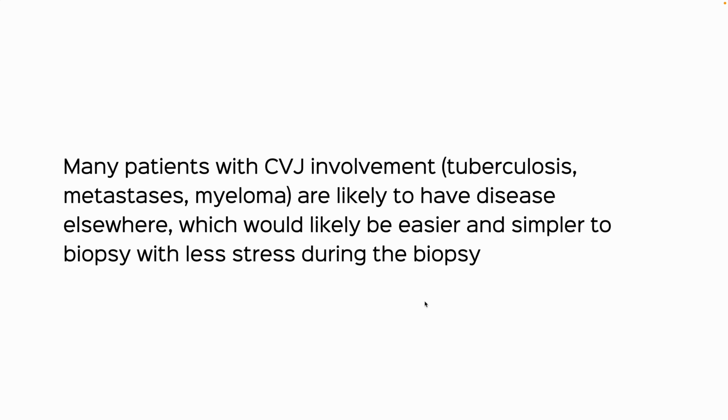Now, in MR, unless asked for, we wouldn't do a whole spine, so that wasn't done. And there were cost constraints, so a whole body PET CT was not done. And none of this is guideline based, so it's not as if this had to be done. This is something you think of doing because perhaps it makes your life simpler.